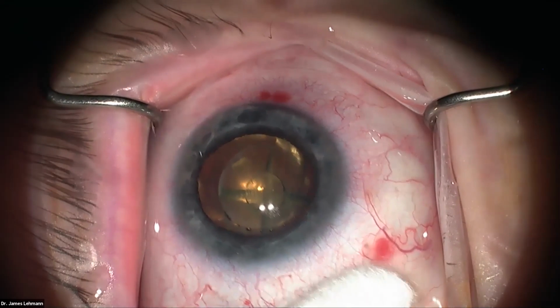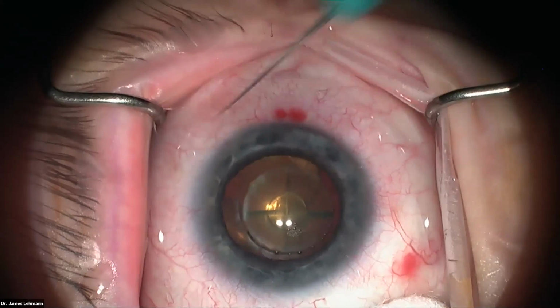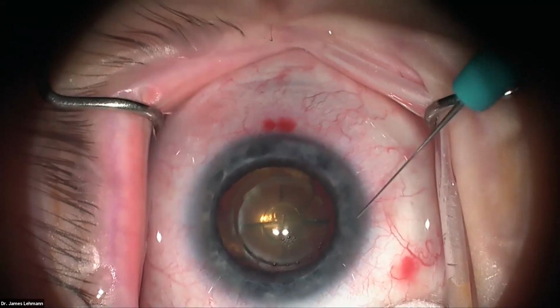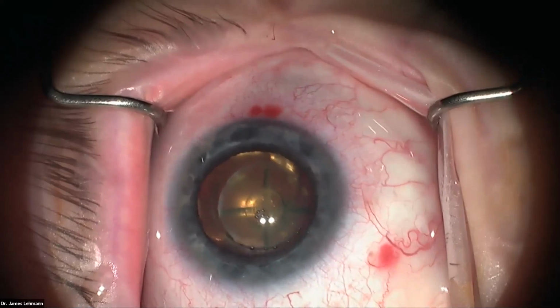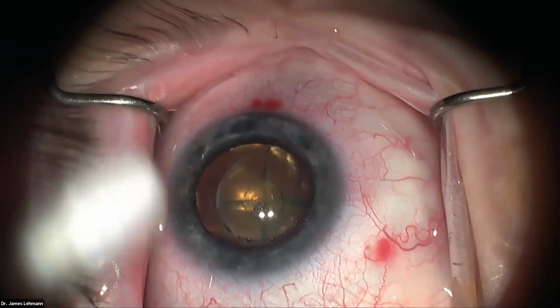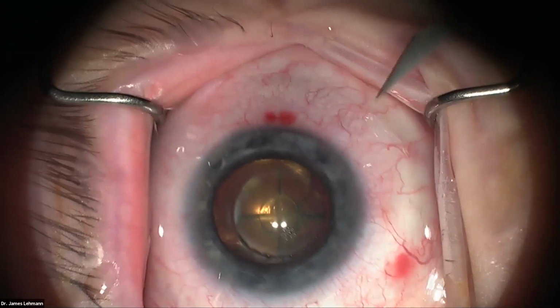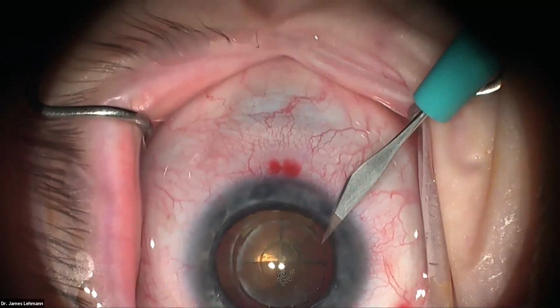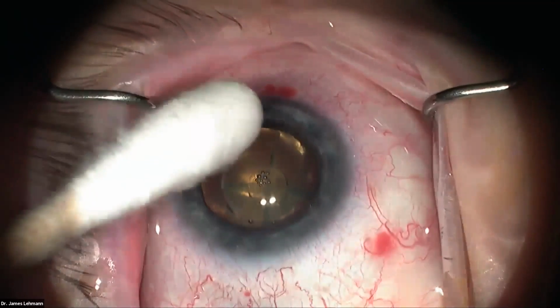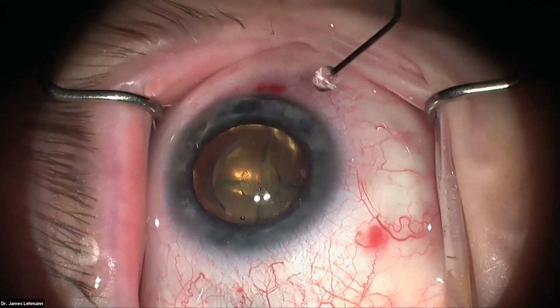So here we're just taking a look. It's a dense cataract, and you can see the rhexis has already been made here. There's also a little LRI here, and there's a couple of subconjunctival hemorrhages. Sometimes that happens with the suction ring from the laser. You may be wondering why, if I did the laser, I'm using a 15-degree blade right now. And that's because sometimes some of the incisions can't be made so posteriorly, and so we still do them manually for the paracentesis and for the keratome.